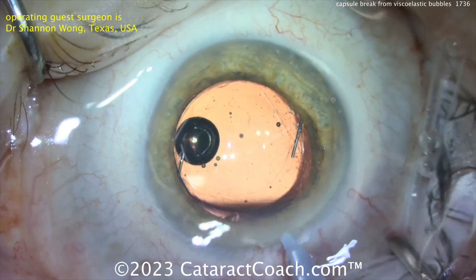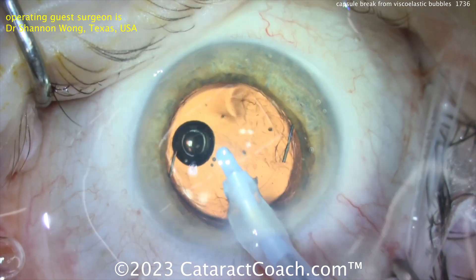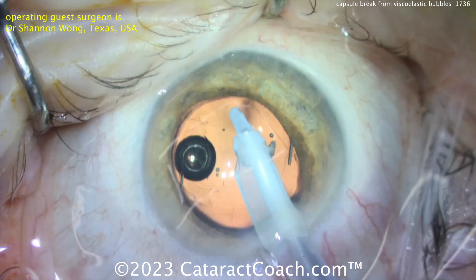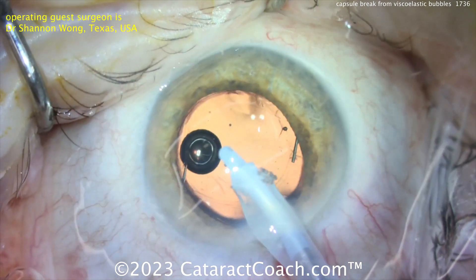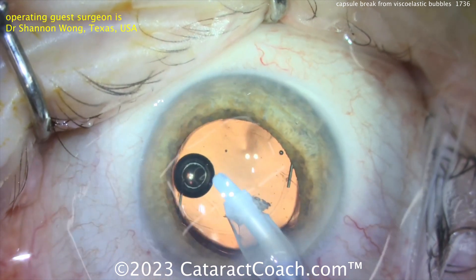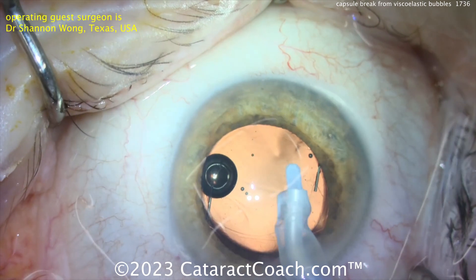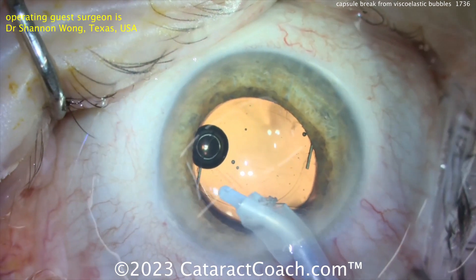For what to do differently at the machine: decrease the flow settings — cut the flow in half, cut the vacuum in half, so maybe 200 mmHg vacuum, maybe 250 mmHg, and about 25–30 cc/min aspiration flow rate, then wash that out carefully. At the end when you pull the probe out of the eye, don't let the anterior chamber collapse. This patient will do very well and the lens will be stable for life.